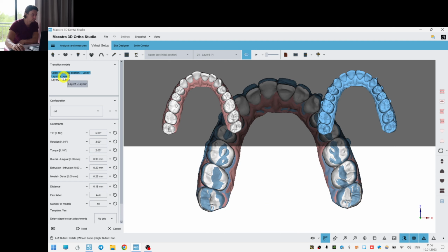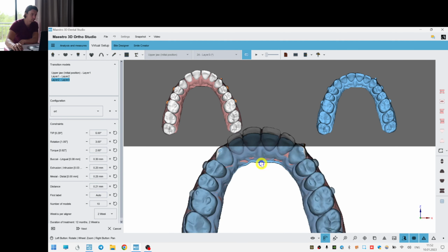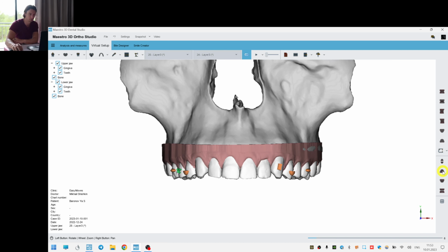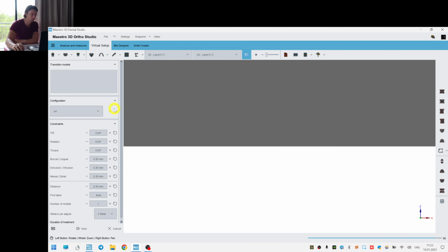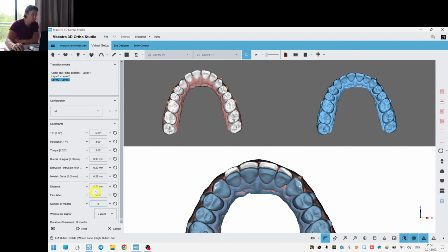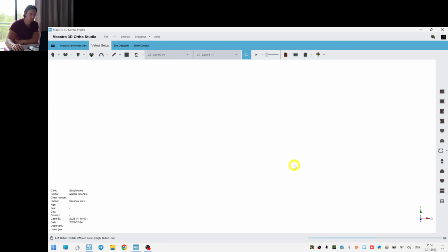Let's make 10. And if I was correct, it's 24. No, it's 25. Yes, we can reduce the quantity on the upper arch by one tray. I think we can do it at layer 2 or 3. Yes, I think here it's fine to make the step equal to 240 microns per step. So now it's 24 sets of trays.